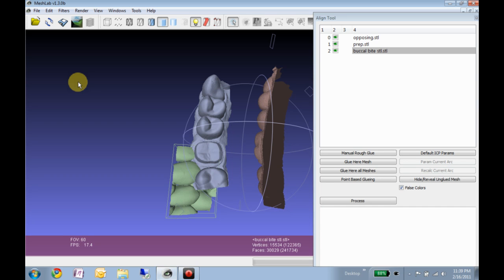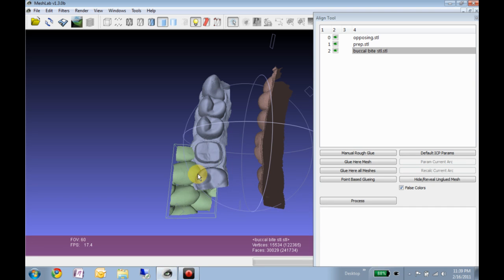If I took three or four images of this whole arch, the software is going to have to do the same steps to stick all those together to sew it into one model or stitch it into one model.